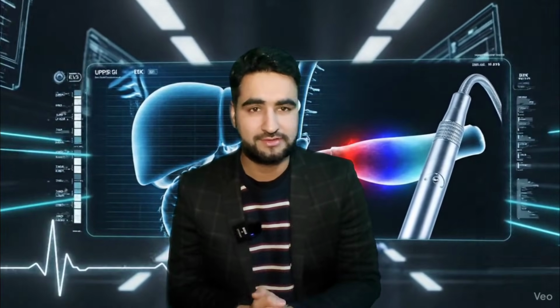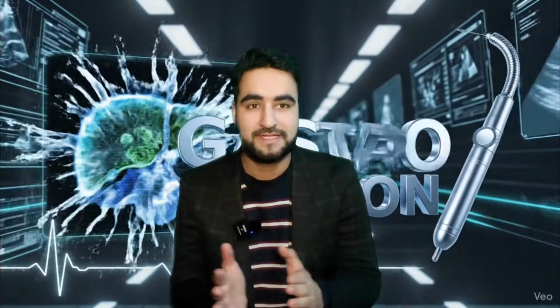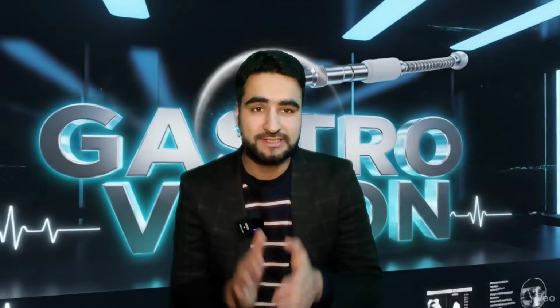Today we are going to demystify the fundamentals of endoscopic ultrasound, the building blocks that every beginner needs to master. If you are a beginner struggling with basic anatomy in endoscopic ultrasound, then this video is specifically designed for you. Here is what you will achieve by the end of this masterclass.